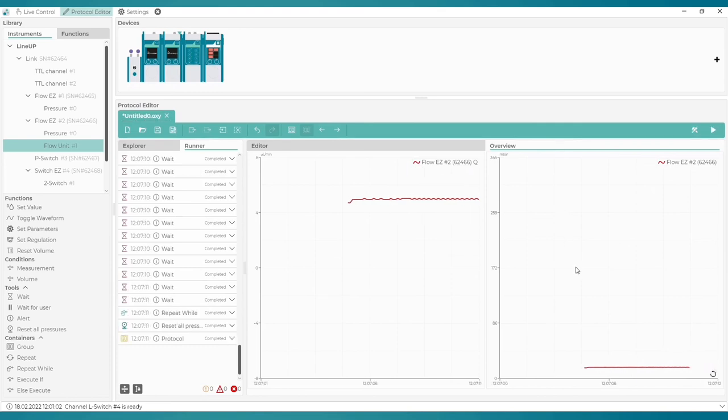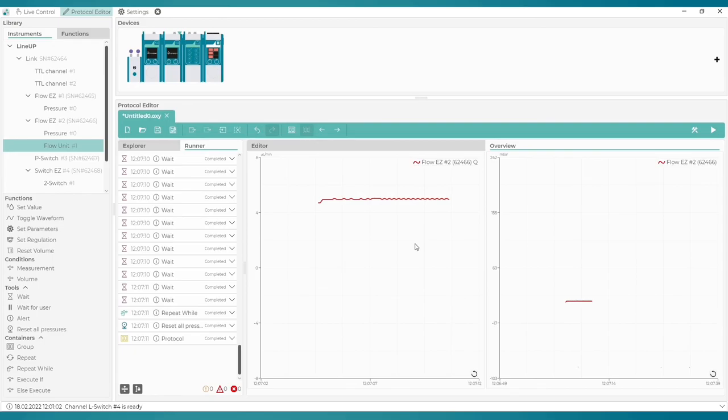As we see, it took about 6 seconds in total for the fluid volume to become greater than 0.5 microliters. And the protocol is finished.